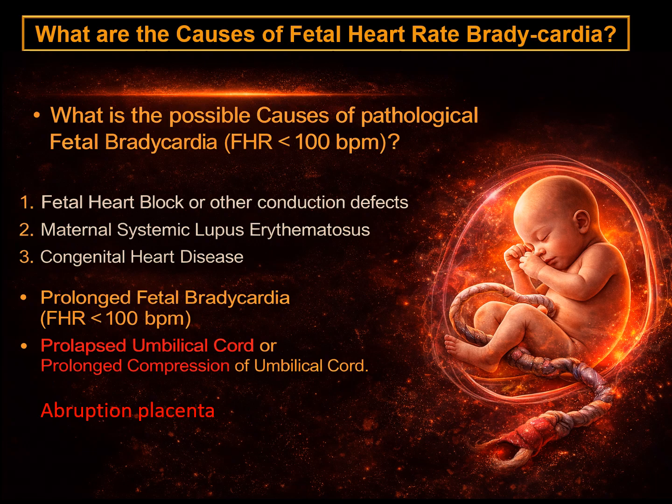What are the causes of fetal heart rate bradycardia? What are the possible causes of pathological fetal heart rate bradycardia? It could be fetal heart block, or other conditions like maternal systemic lupus erythematosus and congenital heart disease of the fetus. Prolonged fetal bradycardia could be due to cord prolapse, prolonged compression of the cord, or placental abruption.